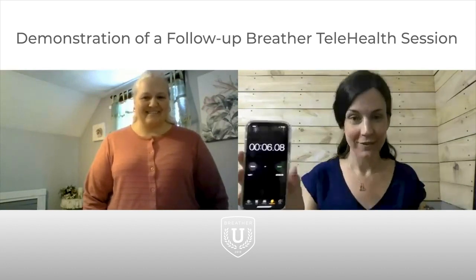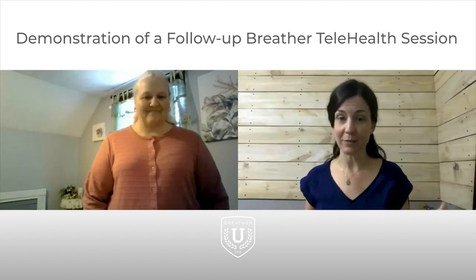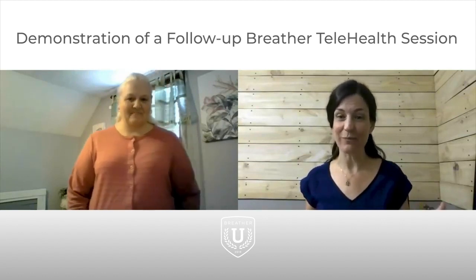Wow. 6. We'll try a couple more times. For whatever reason, it usually takes a few times to get your groove, but that's about what you were on your eval. Okay. So let's think about using your diaphragm and a nice steady ah, and let's see what you can get. So your first one's 6. I'm going to write that down so I don't forget. Because we're going for maximum, so I'm not averaging them. I'm going for the best. Okay. Whenever you're ready.